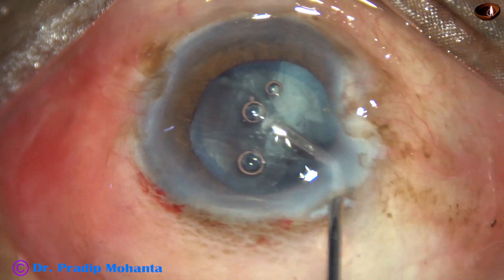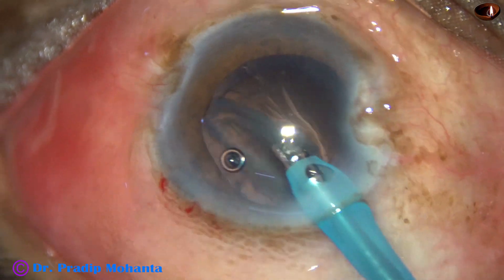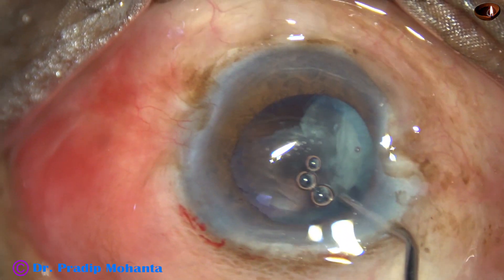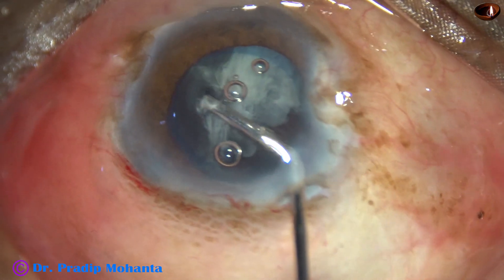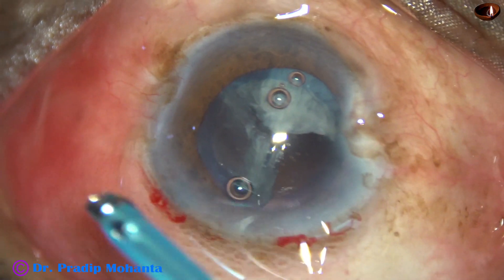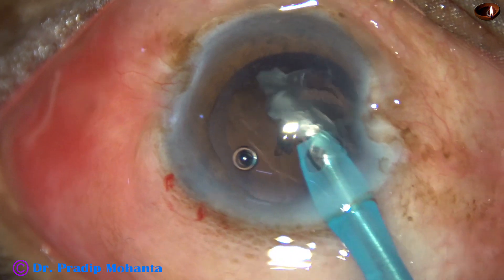Now I inject Visco, and let us observe this in slow motion. The most dangerous situation is if we try to catch the epinucleus without lifting it up. So I inject Visco, get the upper edge, and as I inject Visco the posterior capsule goes behind. By the Visco cannula itself, I lift the epinucleus sheet up, and it gets torn at the center. Now the epinucleus sheet can be easily removed without any fear of catching the posterior capsule.